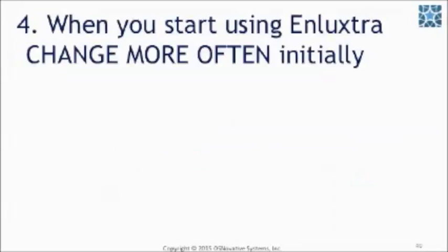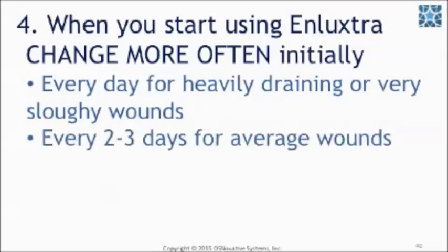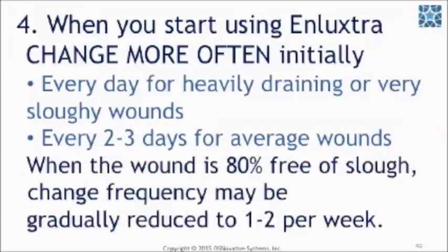When you start using Enluxtra, change more often initially. Every day for heavily draining or very sloughy wounds, and every 2 to 3 days for average wounds. When the wound is about 80% free of slough, the change frequency may be gradually reduced to once or twice per week.